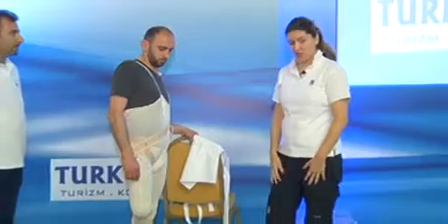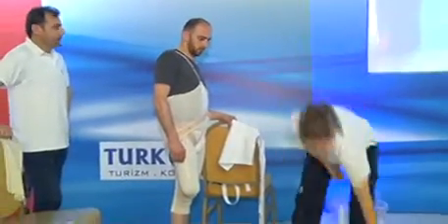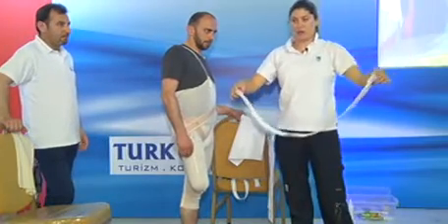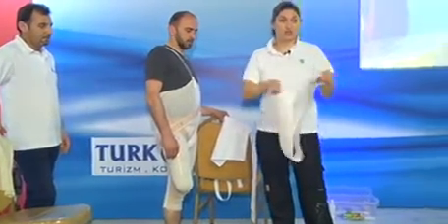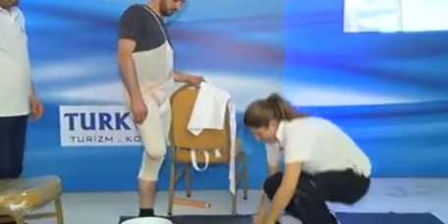Okay, so what we would go ahead and do is start the plaster. I've made some slabs. So I have a longer slab here, and this will go from medial to lateral and cross over the trochanter as well.